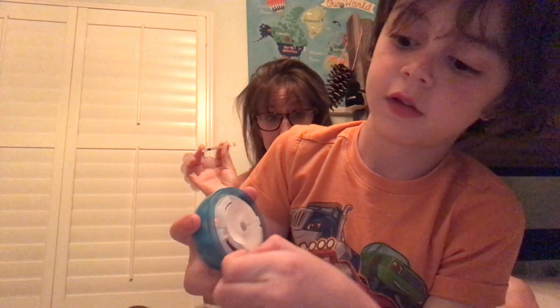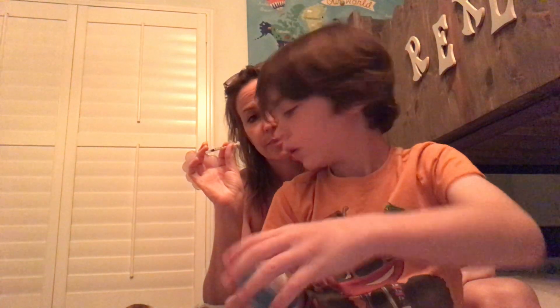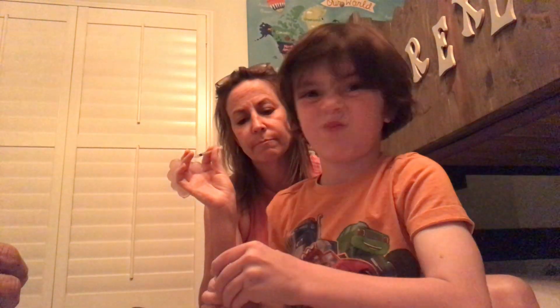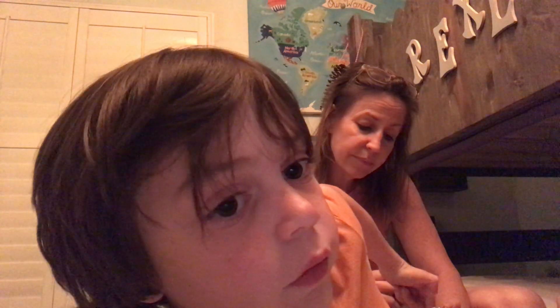Hold it — Daddy will hold it. Pull hard, really hard, pull it back so it snaps. Nobody's going to see because your position is off camera. Let me do your Tresiba real fast. Hi camera, hi everybody. That's the ice — tell me when you're ready. Do it right about there. Ready? My leg went up, just like that. Tresiba is finished.